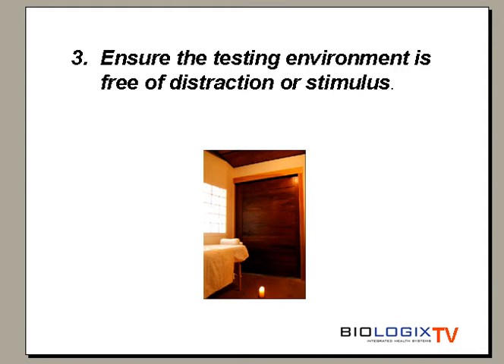A few things to remember here: if you stay in the room with the subject, your presence is a distraction. Irrespective of how quiet you are, you will distract the client. As soon as you see the first 3 measured breaths that ensures everything's working correctly, get out of the room. Music, forget that too. Irrespective of how soothing you may think it is, again, it's a distraction.